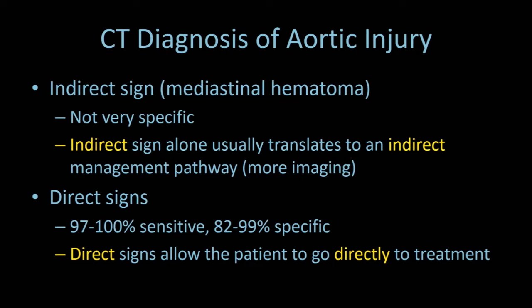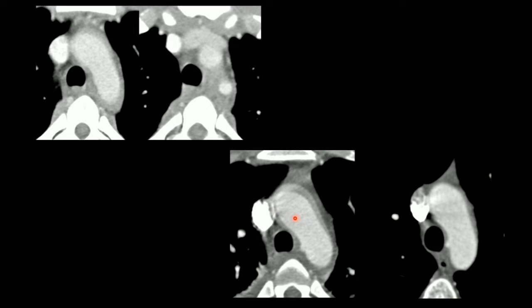When it comes to making the diagnosis, the indirect sign of mediastinal hematoma alone is not very specific and usually translates to an indirect management pathway, meaning more imaging. Direct signs are very sensitive and specific and allow the patient to go directly to treatment. This patient involved in a motor vehicle collision has blood around the aorta touching the great vessels, but no definite acute injury. At 48 hours, they've developed a small outpouching.